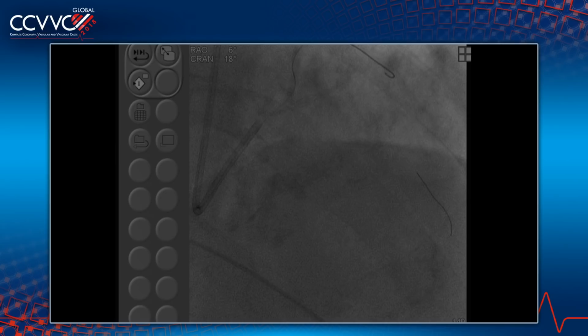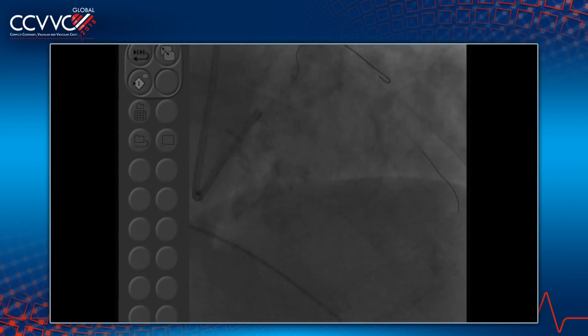Would anybody use orbital atherectomy? Mark Reisman, would you use orbital atherectomy over rotational in a case like this? Anyone here on the panel? I think this wouldn't be a bad case for it, but my experience with rotablator is so much more vast, I'd obviously be more comfortable with it, especially controlling sizes in the left main, 1.75 to the circ, 2.0 on the LAD. Roberto, how would you approach this? Are you in agreement with this plan as they're putting wires down?